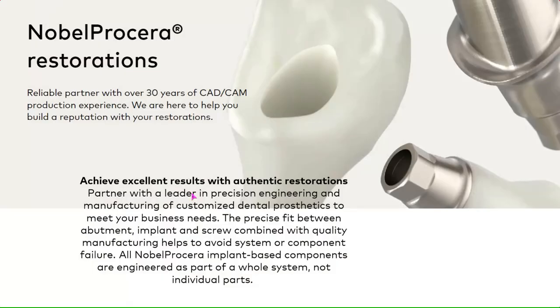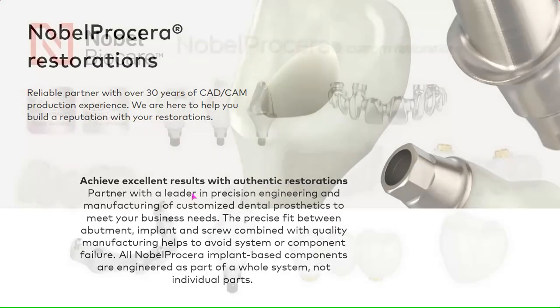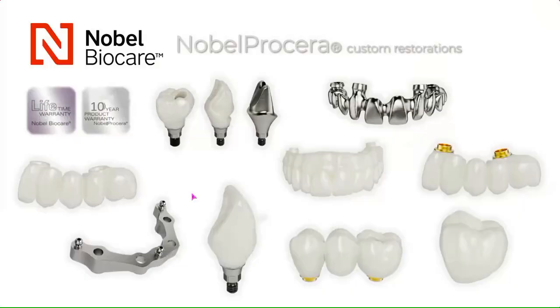We've come a long way, but we achieved this excellence through partnering with our leading precision engineering manufacturing of our prosthetics with precision fit, and really what goes into what we do. There's a lot of precision, a lot of manufacturing techniques that go into doing what we do that make NobelProcera restorations what they are. With our restorations, we do have a full product portfolio.